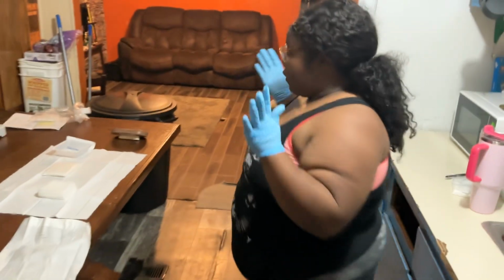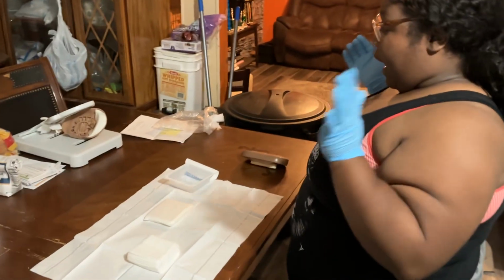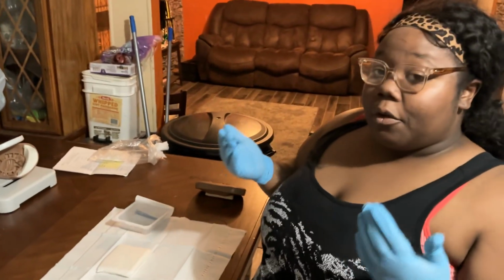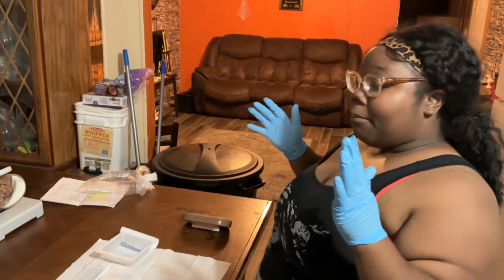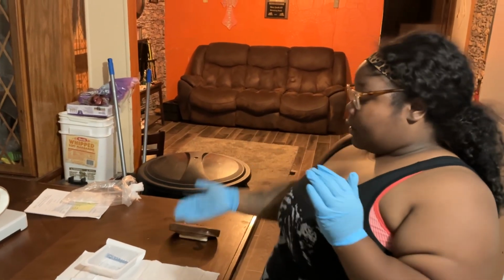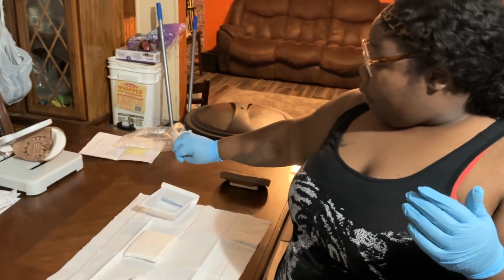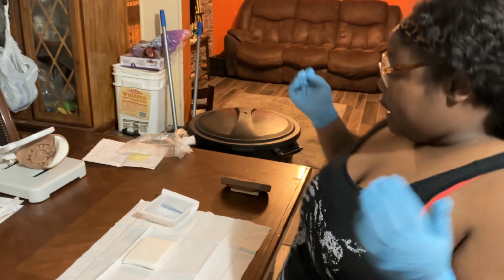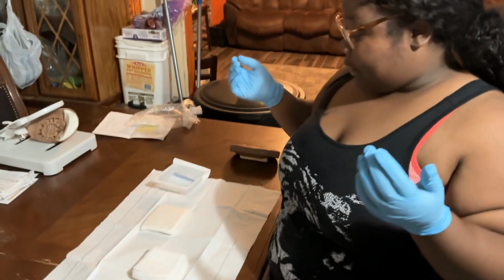waist. Okay. In this moment, they did not put any normal saline in my kit to put inside of my sponge tub. But now I am going to go ahead and pour me some normal saline in so that I can clean my incision.